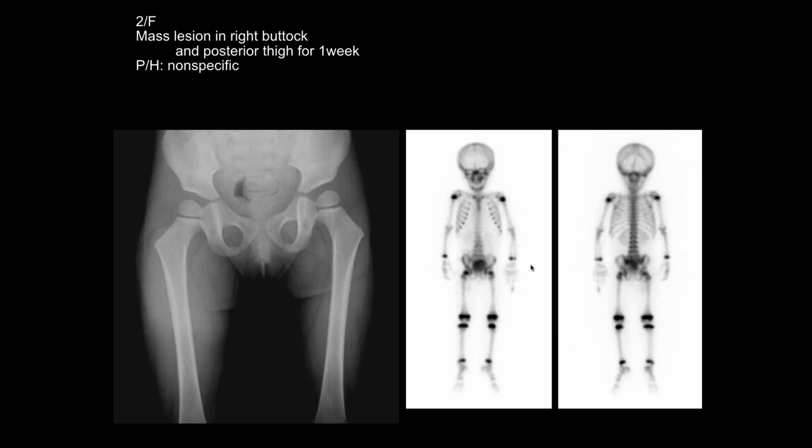Okay, Max? Yeah, so we got a plain radiograph of the pelvis and femurs, and we have a bone scan.